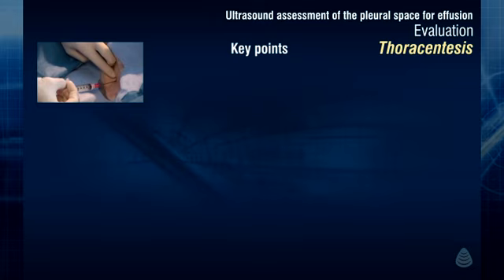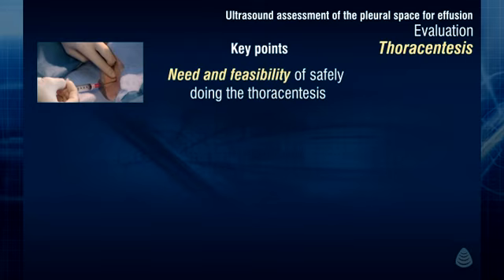Once the effusion has been well assessed, one must determine the need and feasibility of safely doing the procedure. It's not because a large effusion is identified that it needs to be tapped or drained if there is no suspicion of an infectious process and if there is no respiratory compromise related to the effusion, such as shortness of breath, hypoxemia, or hypercapnia.